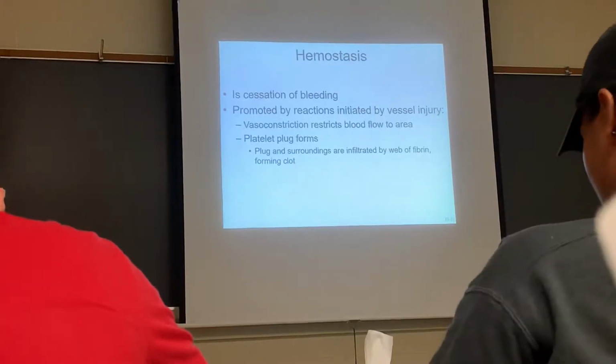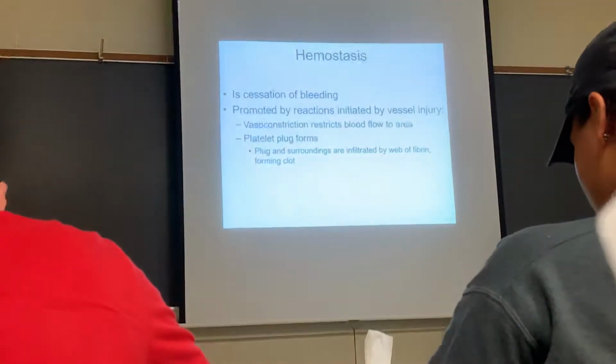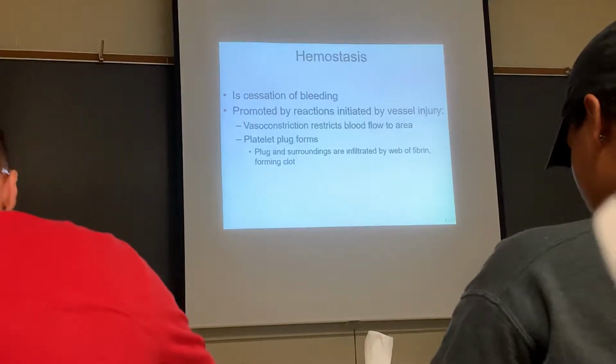Okay, so anyway, let's talk a little bit about clotting, and like I said, we'll go over the white blood cells, what they look like together, and then I'm going to let you take a look at your blood slides, and we'll do differential cell counts today with the microscopes, so it should be pretty quick.